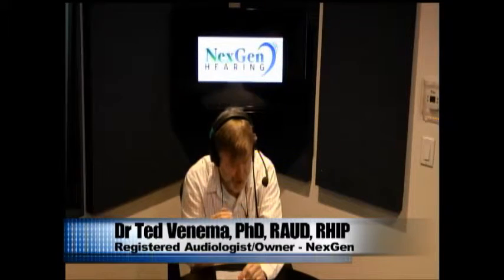Then we test your hearing sensitivity under headphones. We'll test the right ear and then the left ear, separately, and we'll give you a tone, and we'll ask you to raise a finger or push a button every time you're able to hear that tone. We make the tone softer and softer until you can no longer hear it. We mark down what that was. Then we go to a higher pitch, and we do the same procedure. We make it softer and softer until we find the level that you can barely hear it.